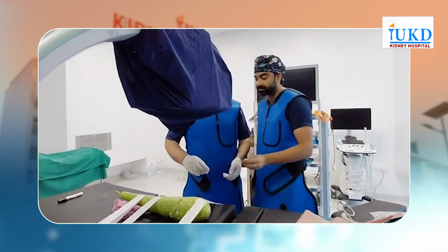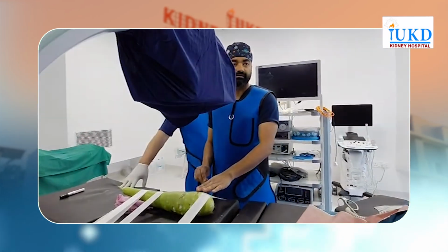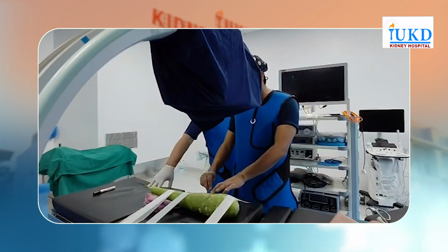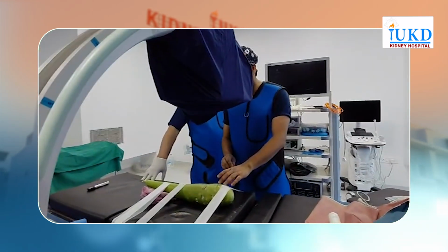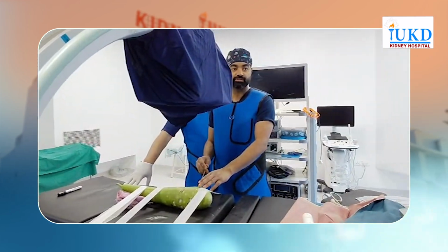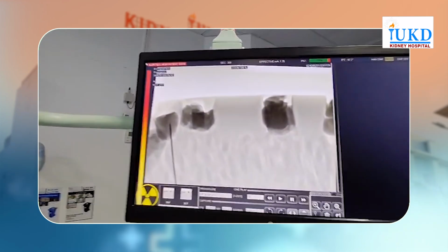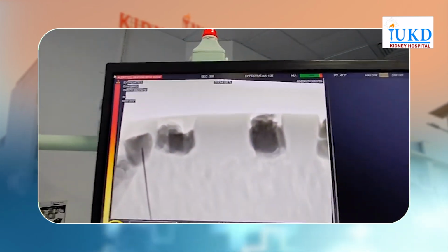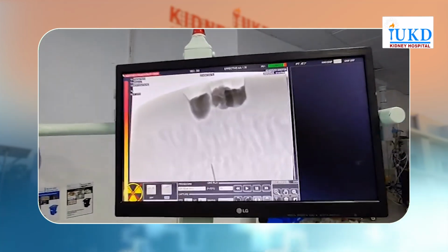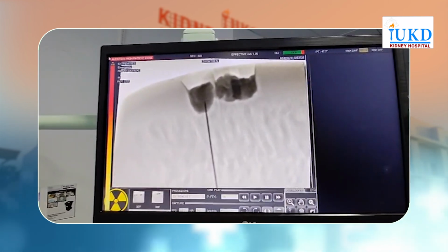Let me show you what lateral descent is. So give me a target calyx here. Suppose it's the same one. This I showed you when you are doing it under the rib, right? Making this angle. This angle is not necessary when you are doing a lateral descent. So lateral descent you can do at 0 and 30 both. So this is my tip. Here is my calyx. I'll make an entry. I'll mark a 5 centimeter distance from the calyx here, okay? At 30 degrees. So I'm going in a 30 degree direction towards my target calyx.